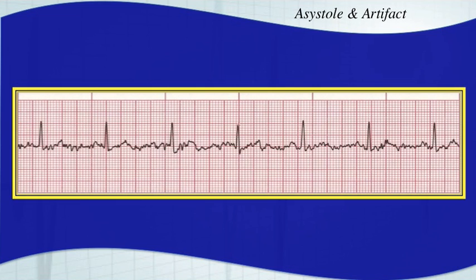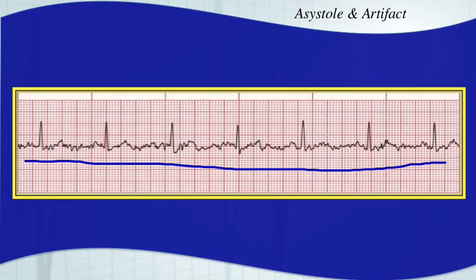Here we go with some movement — this patient looks to be shivering. You've completely lost your baseline, and it's very hard to identify your P-waves, which makes it difficult to identify if there's some sort of arrhythmia going on. You're going to want to try to provide the patient with a blanket, keep them warm, and eliminate that shivering.